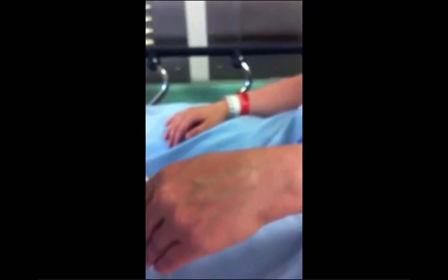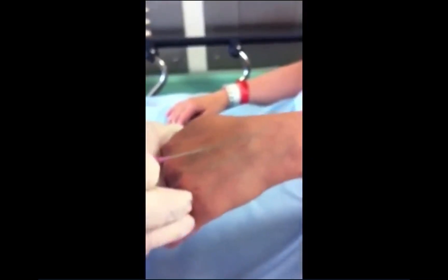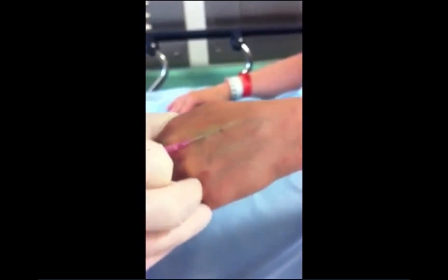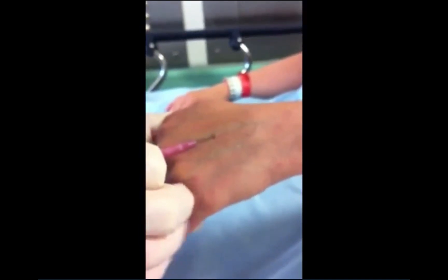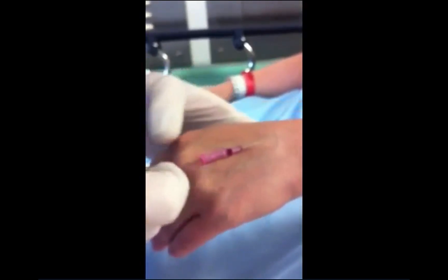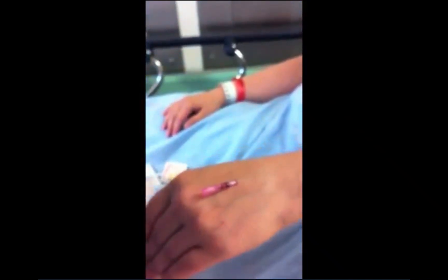Cleanse the site with an alcohol swab and avoid touching the insertion site once it has been cleaned. Apply distal traction on the skin to immobilize the vein. Puncture the skin overlying the vein at about a 20-degree angle, then immediately decrease the angle of insertion and advance the needle and catheter. Avoid applying downward pressure, which can result in the vein collapsing. Pressure should be gently applied in the direction of the needle. Try to visualize where the tip of the needle is in relationship to the vein and make small adjustments to enter the lumen.